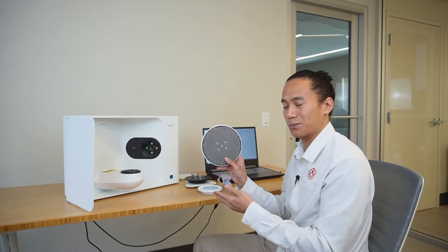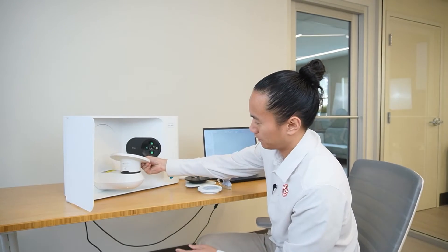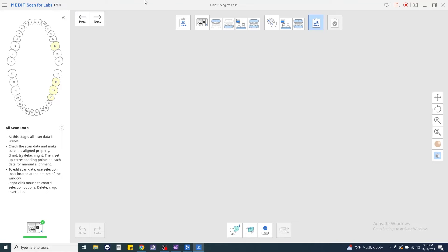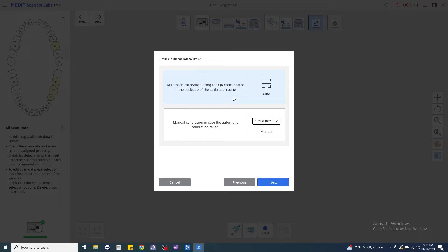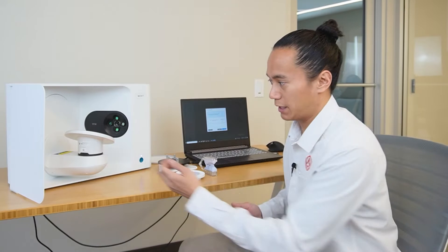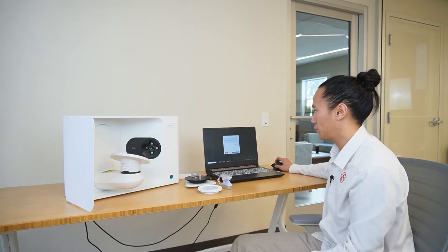The first thing we're going to do is we're going to take our calibration plate. We're just going to set it along the scan stage. Bottom left-hand corner of the MediT Scan app, we're going to click the calibration wizard icon. Click Next. There's going to be two options.